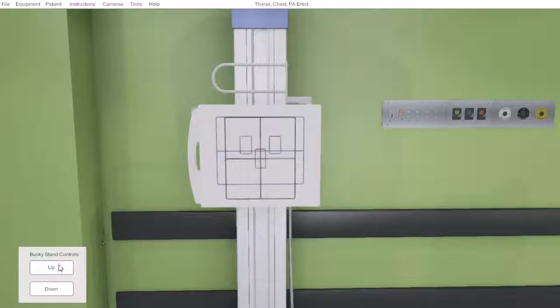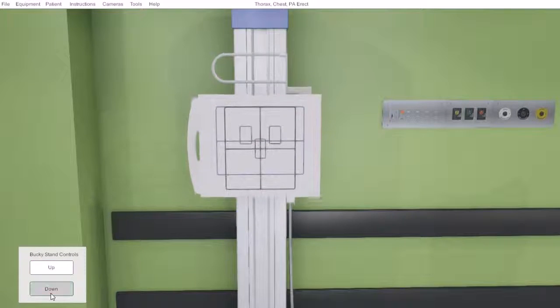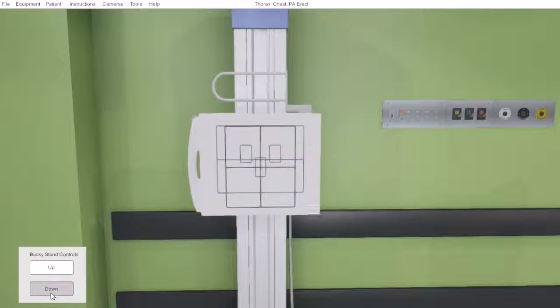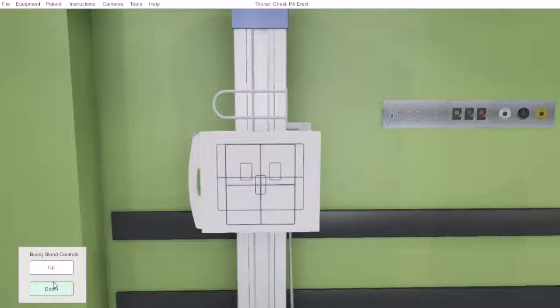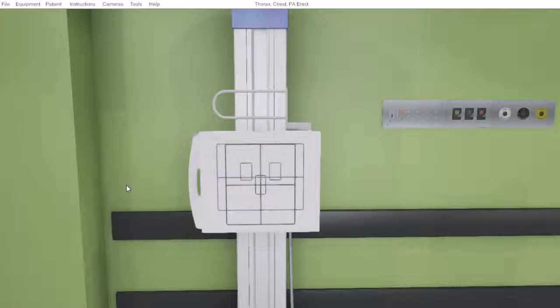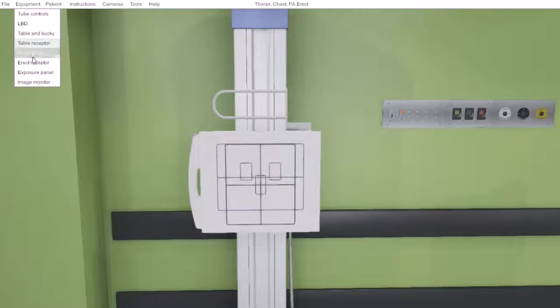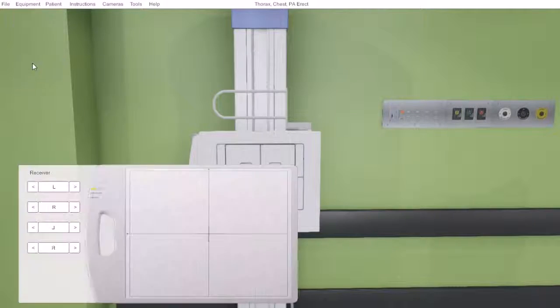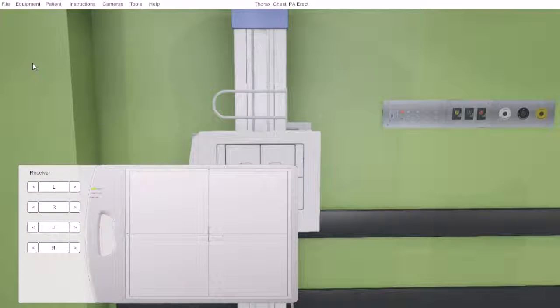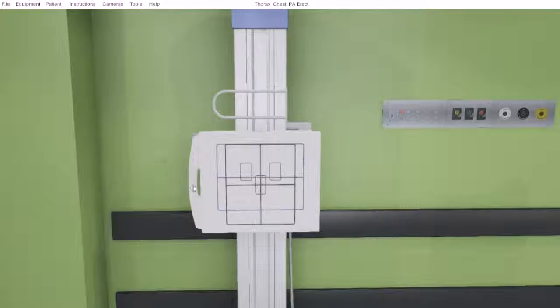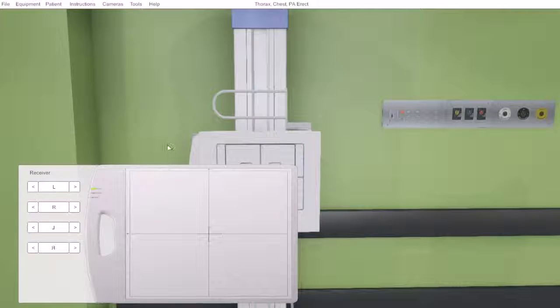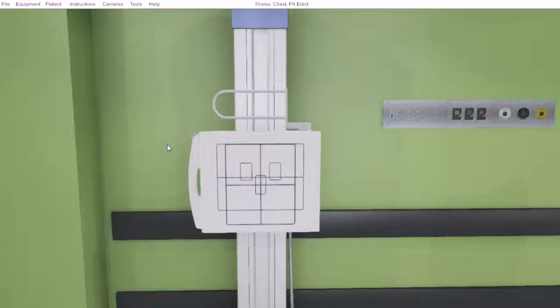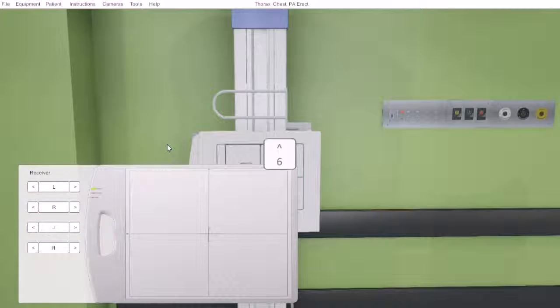This then allows us to interact with the vertical movement of this bucky. If we wish to place a side marker, we can find our erect receptor under the equipment menu, we can actually click on the receptor as we see it, or numerical key pad number 6.